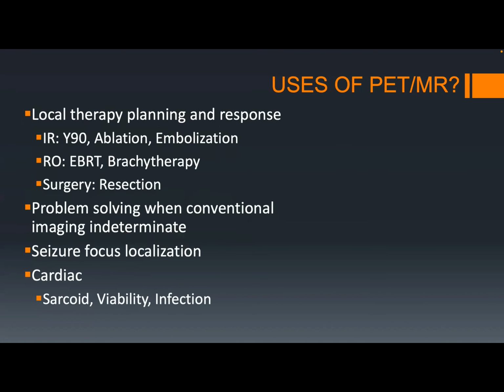What are the uses that we've been finding? Unlike most places that have PETMRs, we have not done much neuro. We are mostly body and cancer.